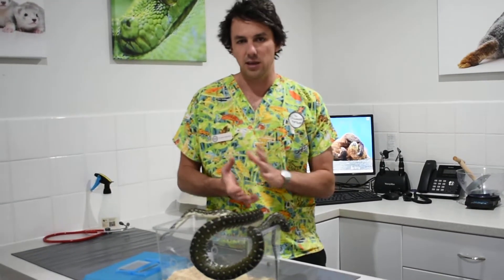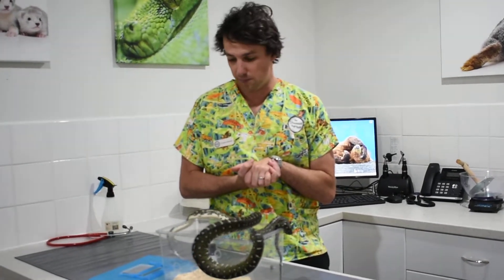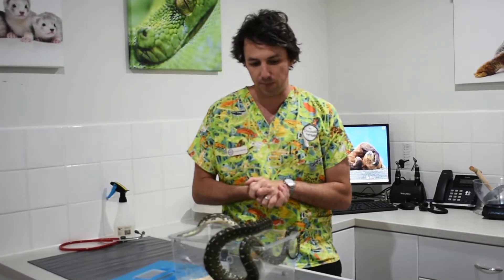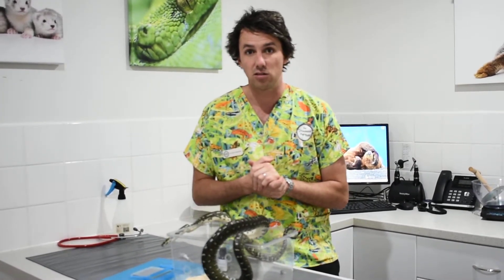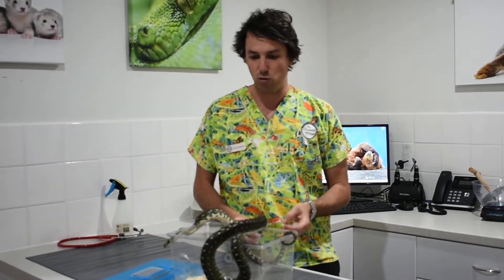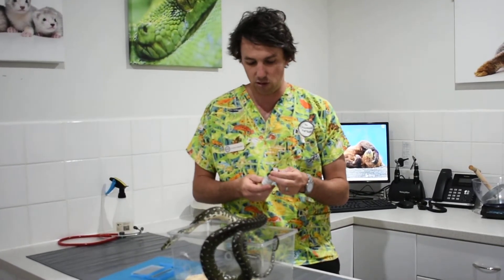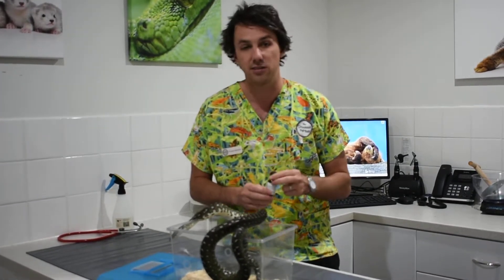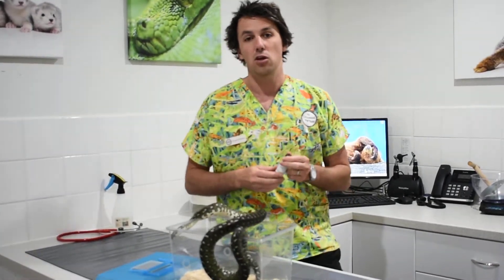Hi guys, so we're going to be learning how to medicate a snake tonight using a small stomach tube, a small feeding tube. Obviously this will be needed for any oral medications that you're going to be doing. There are a couple of things you need to get ready before we start, and we've got our patient Noodle here today who needs medication, so we're going to be using her to demonstrate.